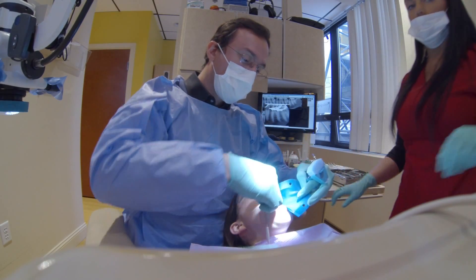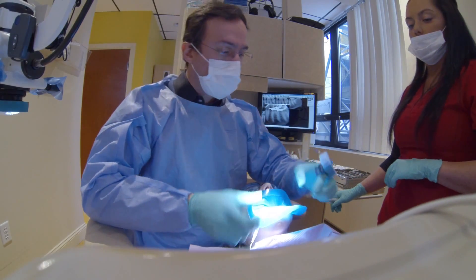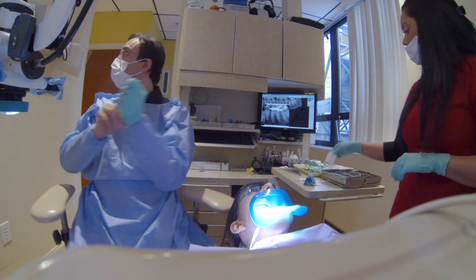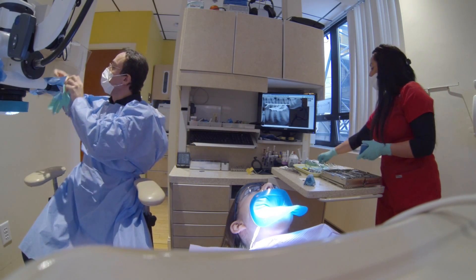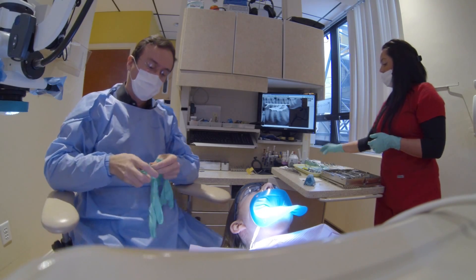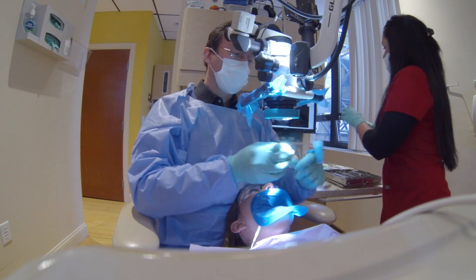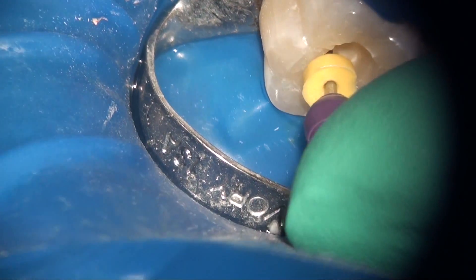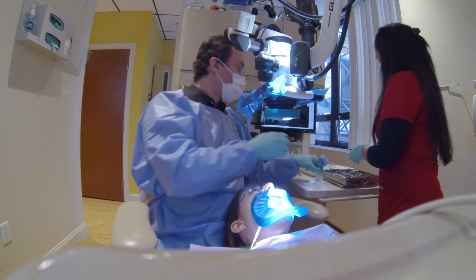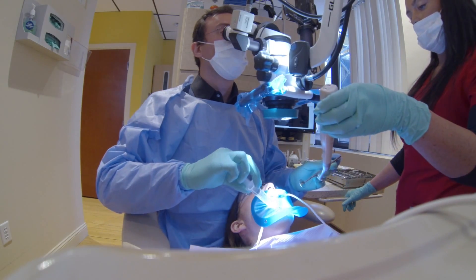Now that we've set the lengths, it's important to note that I've been manipulating the patient's cheek and face and putting the bite block back in, so I've contaminated my gloves. It's important to change to clean gloves so that you don't carry bacteria from touching the patient's face and saliva. I confirm the lengths again, and now we set all four files in the EndoSequence setup to the shortest length.